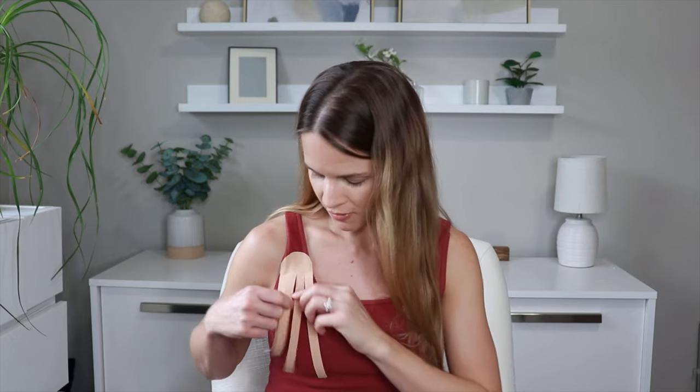We want the fluid in the breast and chest to move towards the lymph nodes — everything in this part of the body naturally goes to the lymph nodes in the armpit. If someone has an affected area we wouldn't go this way, but if it's healthy this is naturally where it wants to go. So we rip off the tape on the anchor end, pull that back, and we want the anchor towards the area we're trying to get the fluid moving towards — the armpit. Place it right outside the armpit, not in it, directly on the skin, and rub it in because warmth activates the adhesive. If someone is breastfeeding, you want to go around the nipple and areola area to avoid irritating it.